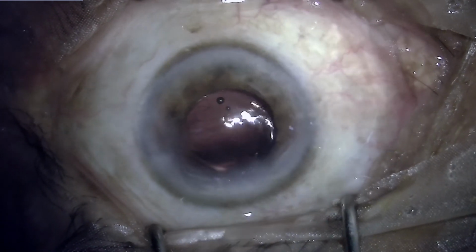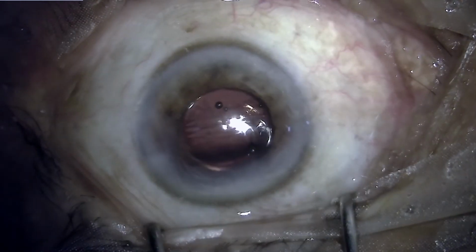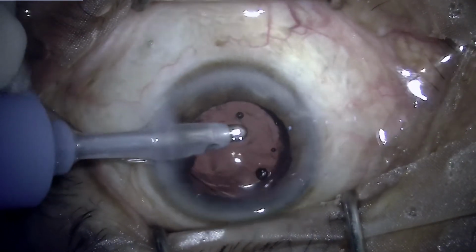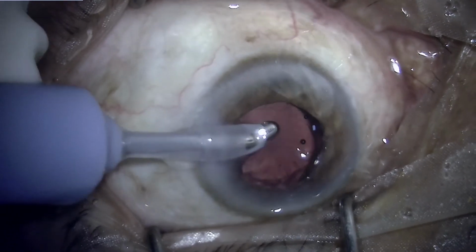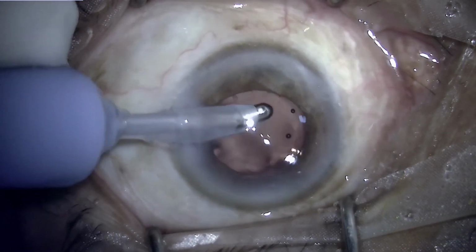So basically this is a demonstration of a cataract which was unexpectedly soft. The phaco technique of horizontal chop failed here, and we had to switch to a modification of the chip and flip technique so as to safely remove the nucleus.